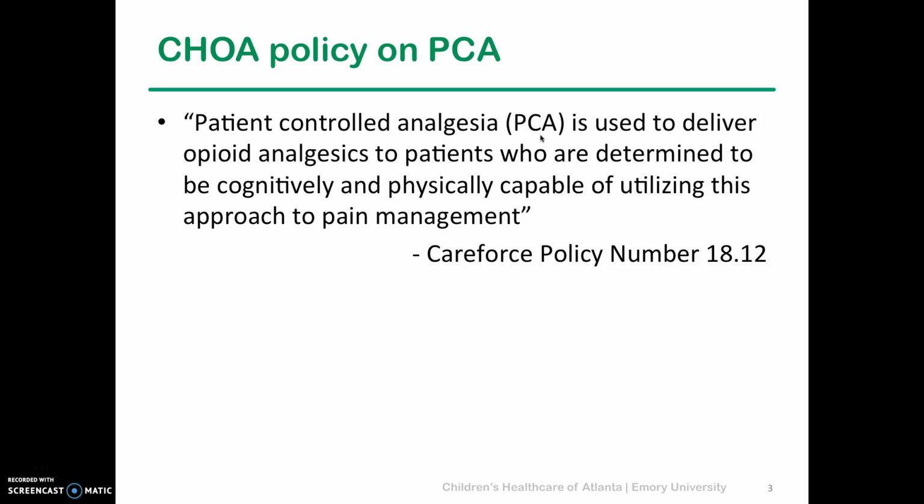The CHOA policy on PCA can easily be found on CareForce and is policy number 18.12. Per the policy, patient-controlled analgesia, or PCA, is used to deliver opioid analgesics to patients who are determined to be cognitively and physically capable of utilizing this approach to pain management. So patients who are in severe acute pain should be alert and able to press a button reliably for themselves to help control their pain.